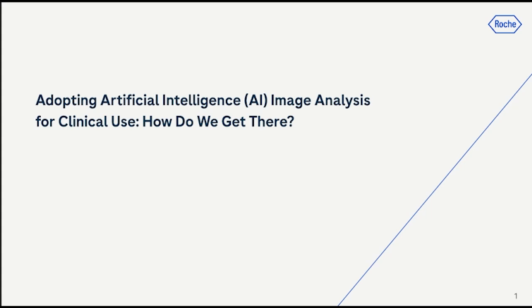all of those scans. And then the last thing I just want to communicate to the audience and everyone, and to your point, which is what is quality for a human to be able to review a slide might be a very different level of quality of what an AI requires to put an output. And that's certainly important in AI assistive tools, but it's especially important in AI tools that are expected to be standalone biomarkers, where the AI is supposed to give an output that no human can check.